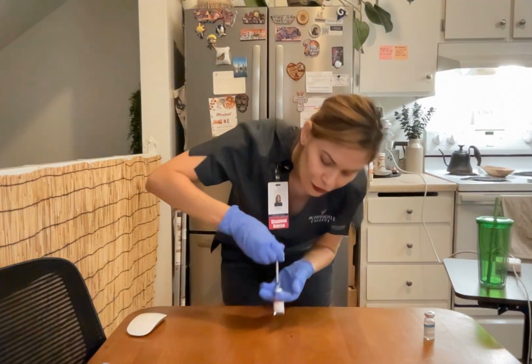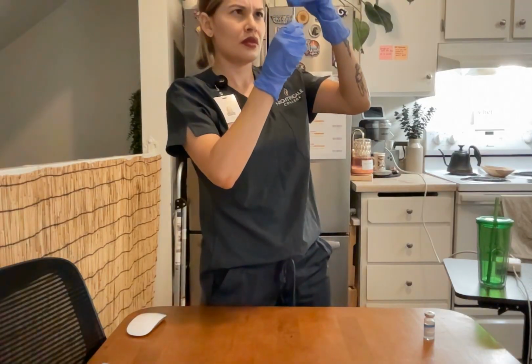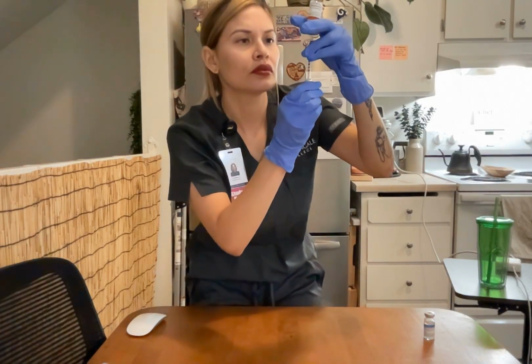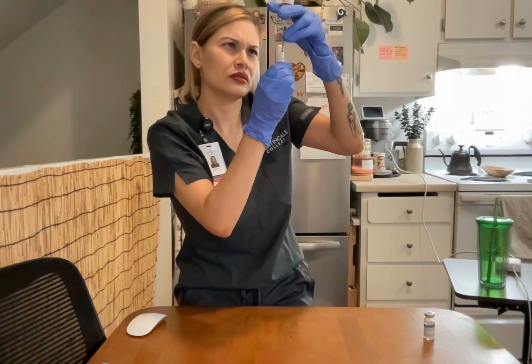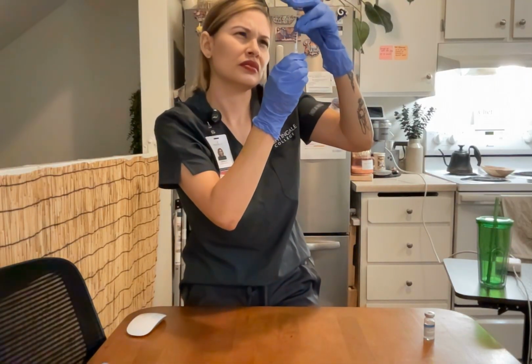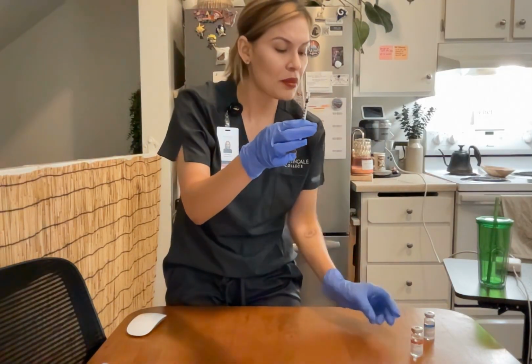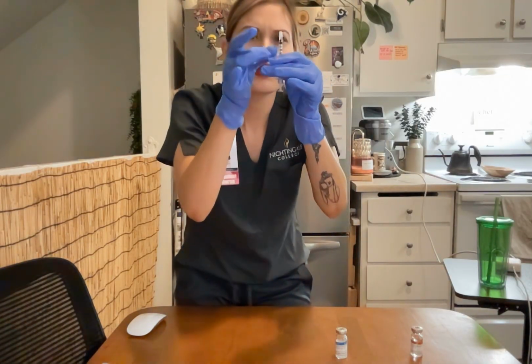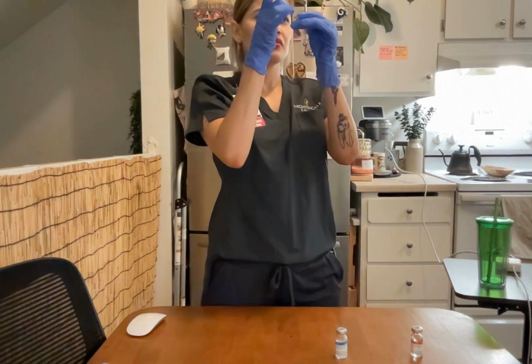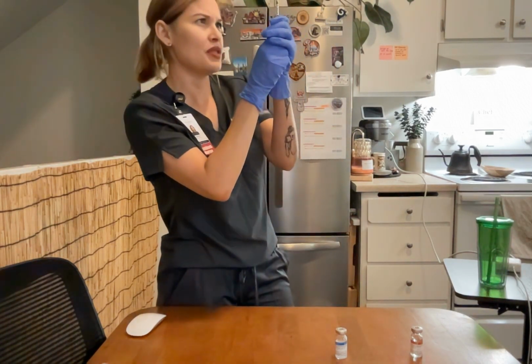Now I'm going to fill the syringe, remove the vial, and now I'm going to tap the syringe to remove those bubbles. I push the plunger to make sure that I remove the bubbles.